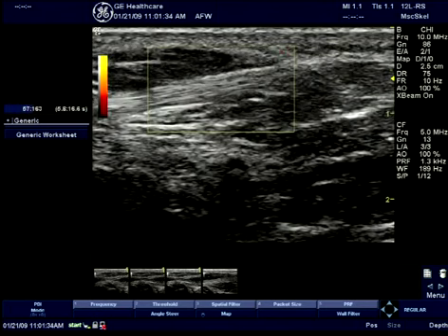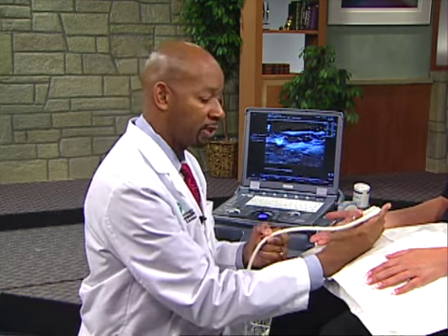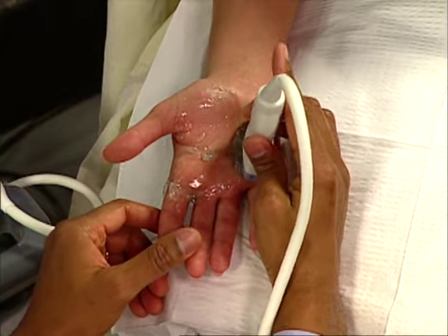We do the same thing looking over the area of the hypothenar region. You can identify some of the tendons and muscles. This is not a huge area where there's pathology. Sometimes patients with rheumatoid arthritis with long-standing disease might have some changes in that area. Essentially you're going to be looking not only superficially, but also deeper for some of the bones as well. You will begin to pick up part of the tendons going to that area and looking at the bony margins. I'm just beginning to capture the beginnings of the fifth metacarpophalangeal joint, and I'm going to slide more proximally to pick up the region of the hypothenar area where you will see some of the muscles and the tendons. Scanning back and forth to make sure there's no changes, no abnormalities, no areas of hypoechoic signal that might represent fluid accumulation. Once you've obtained the longitudinal view, you can do the same thing transversely, picking up some of the carpal bones and part of the metacarpus and the other tendons in cross section.